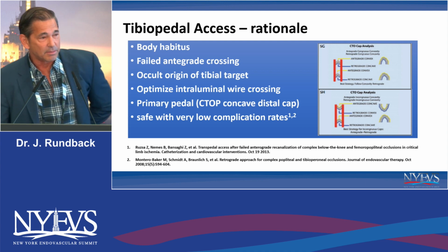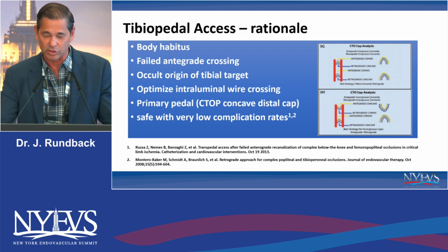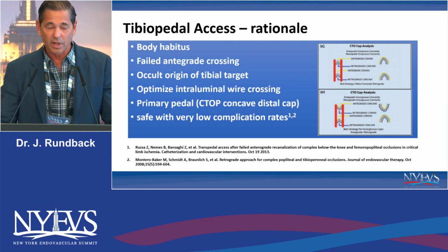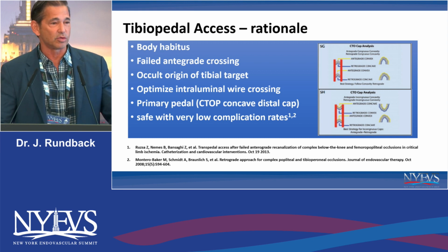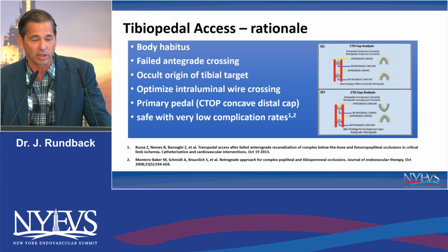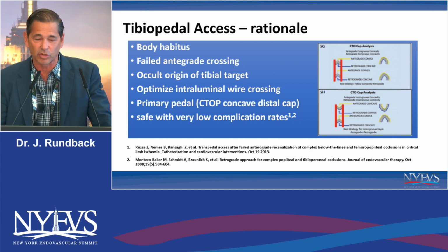Anyway, to get to my topic, this really should be Art Lee's topic. I've liberally used some of his slides, which I've used through the years and never reproduced because the quality of his are so good. Why do we use tibiopedal access? Why not just do things femorally? Or we saw a great case yesterday, a live case which was done for a brachial radial approach. Well, obviously a lot of reasons, and I'm sure you're familiar with this from your own experience.